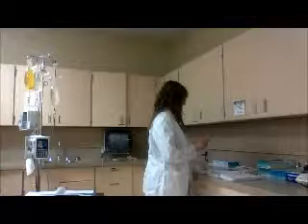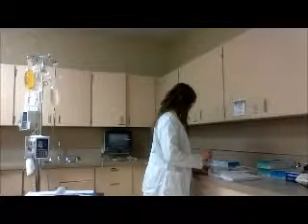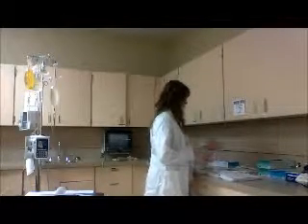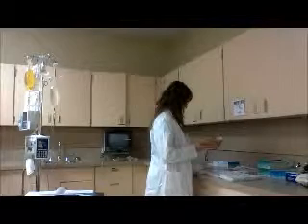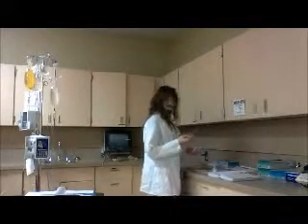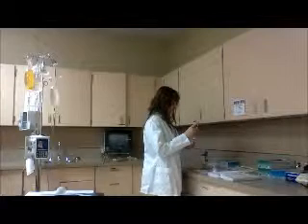So I'm going to inject 0.75 milliliters of air in and withdraw 0.75. Now I can take this and put it in an empty syringe.